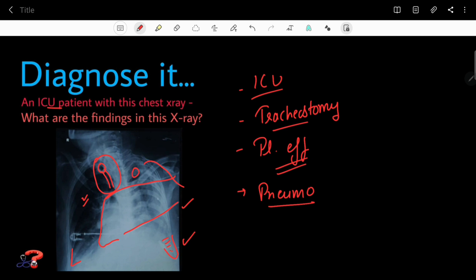There are no lung shadows visible here. This is not regular lung parenchyma — this is just air present between the two layers of pleura. So on the right side there is pneumothorax, and what is in the center is basically the collapsed lung.